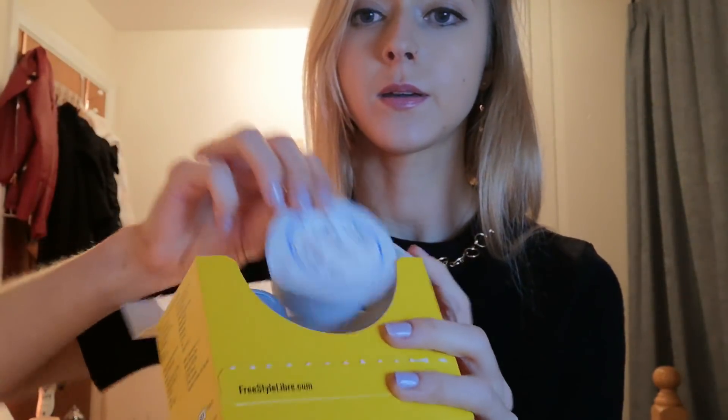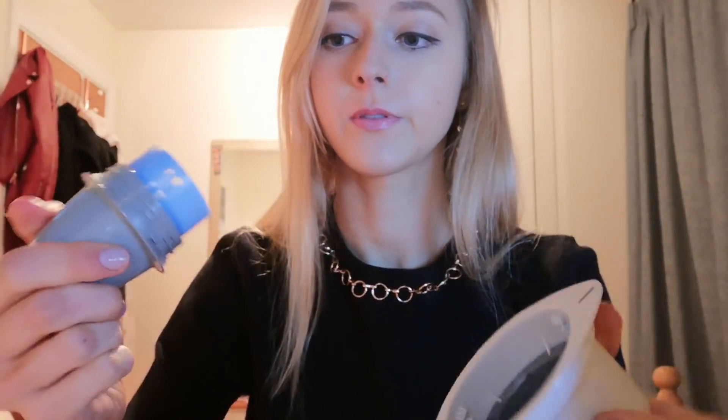First things first is how to apply it. As you can see it comes in this little box, and in the box are two packages. This is the sensor and this is the applicator, and you basically combine them into one. You peel this open, then open this up, and connect them together.